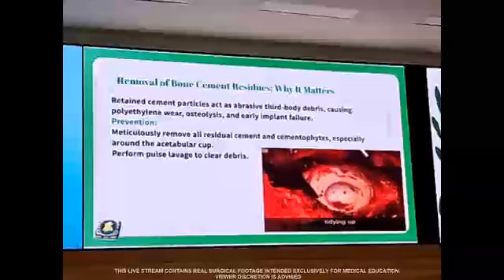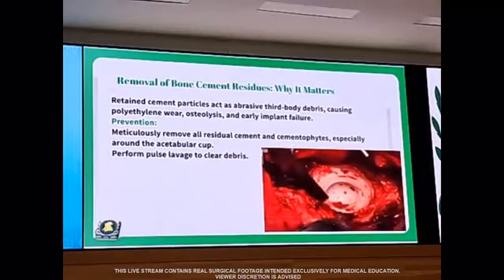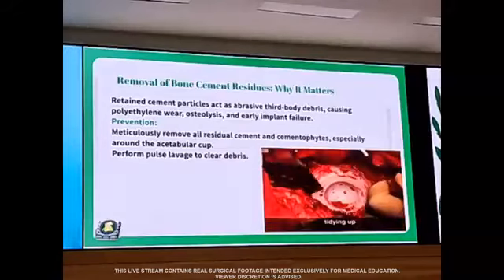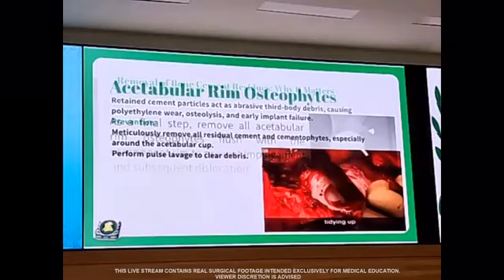Retained cement particles act as abrasive third body debris, causing polyethylene wear, osteolysis, and early implant failure. Meticulously remove all residual cement, especially around the acetabular cup. Perform pulse lavage to clear debris.